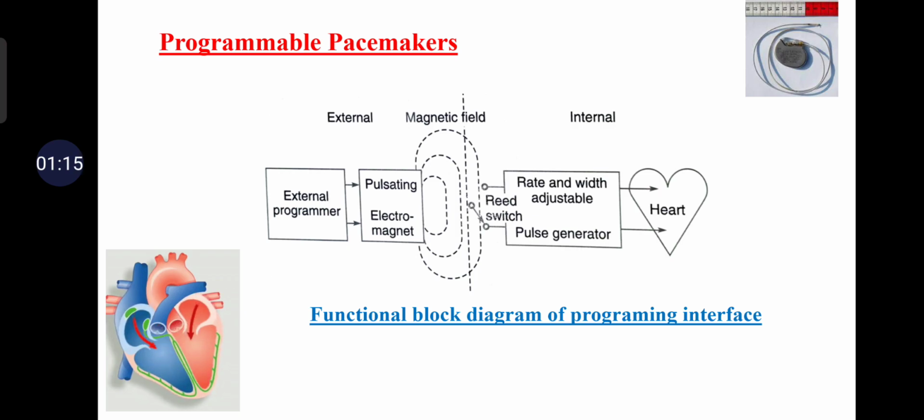So out of all these methods, we can go for the magnetic field method. It is most widely used because of its simplicity and minimal power requirements. That is a very important one.